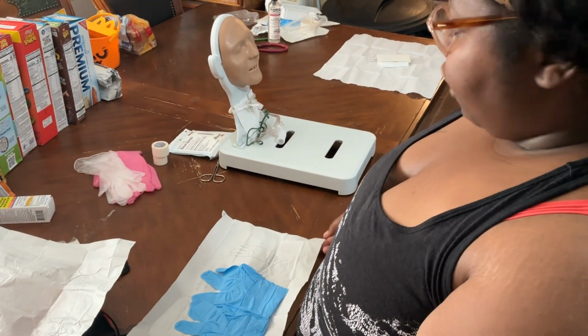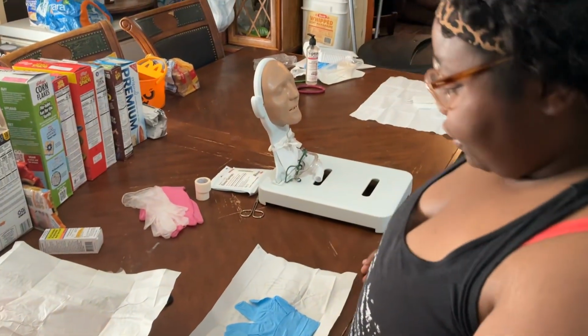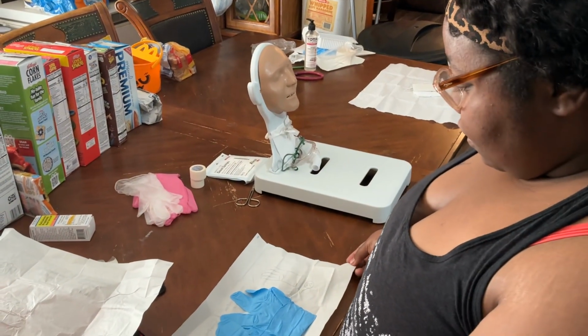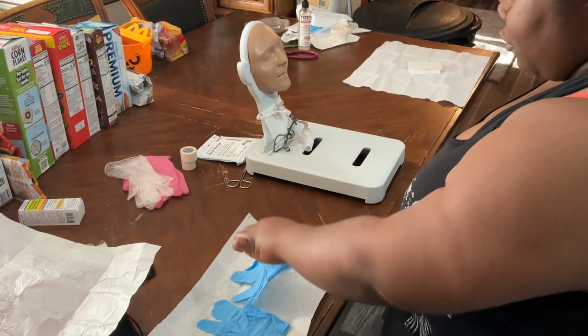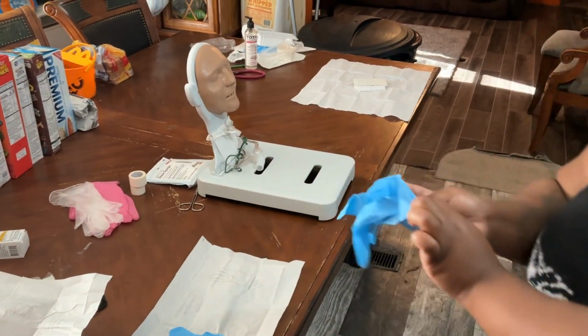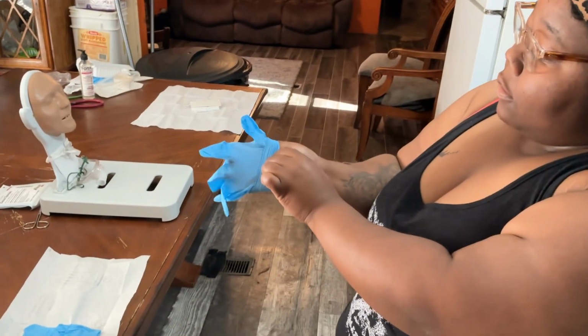Still checking on my patient. Are you okay? You're not in any respiratory distress or anything? Patient states no respiratory distress at this moment. Right. Okay, I'm going to go ahead and perform trach care on you at this moment. I don my sterile gloves. I'm touching the inside of these gloves, which is okay.